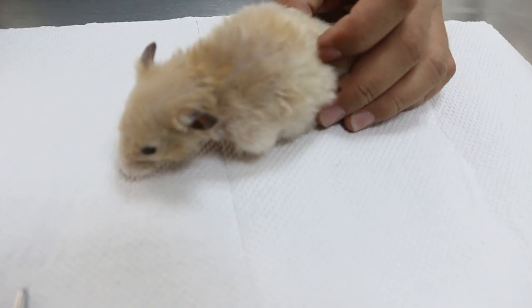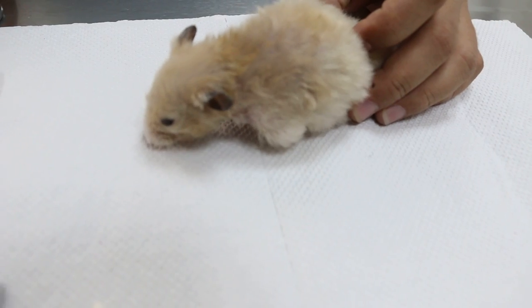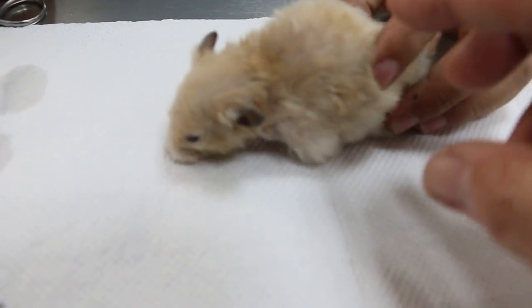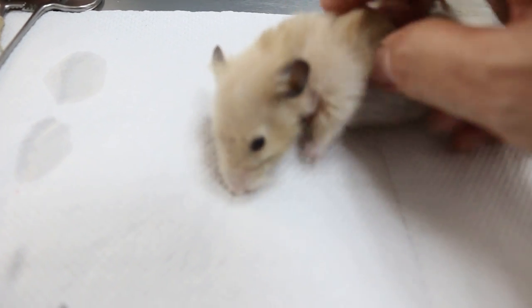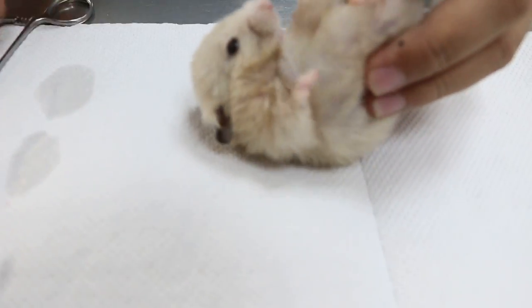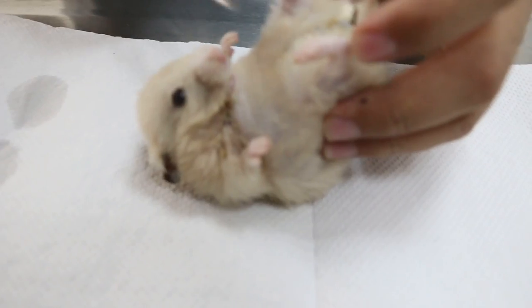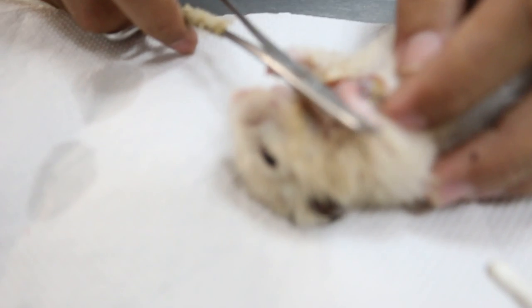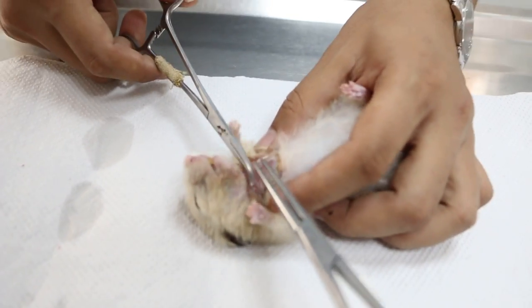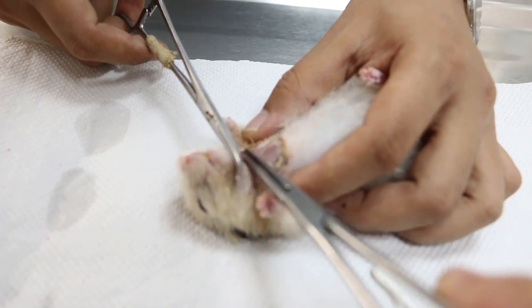Sunday, March 8, 2015. This patient came in yesterday with neck cellulitis. They were stitched by the other vet three times but the wound had broken down, so yesterday we took out the stitches. As you can see, the neck wound after removal of the tumour is too big.